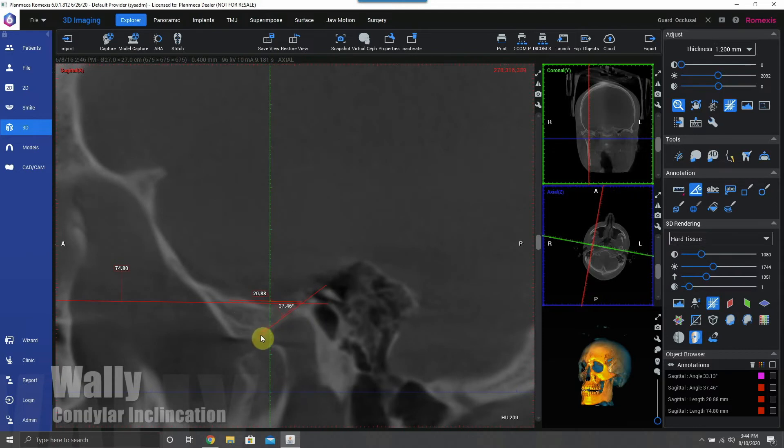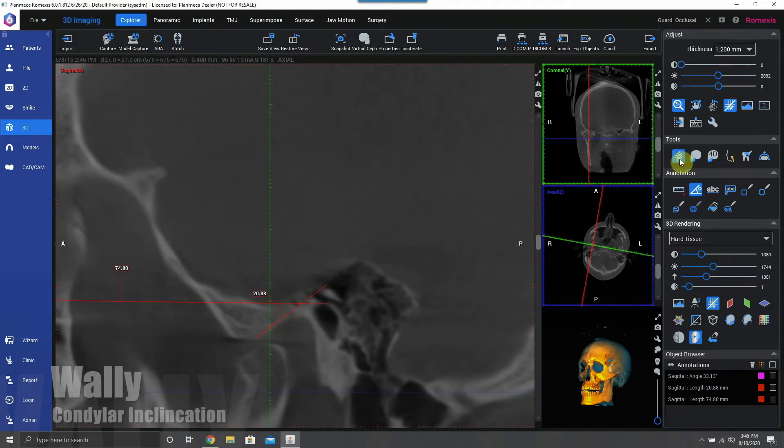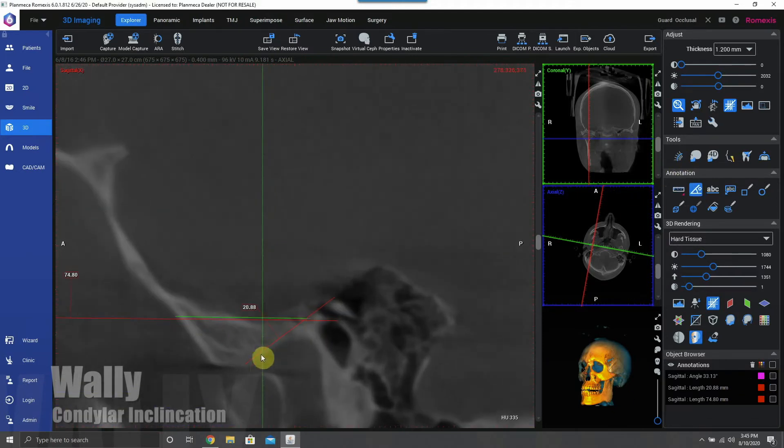So here we go, measured right here — 34 degrees.